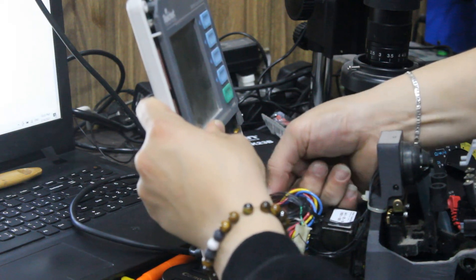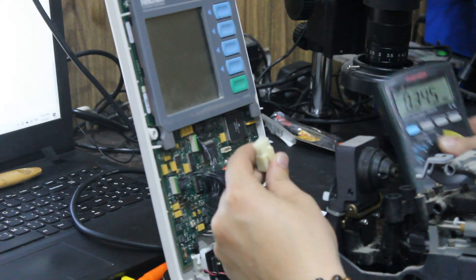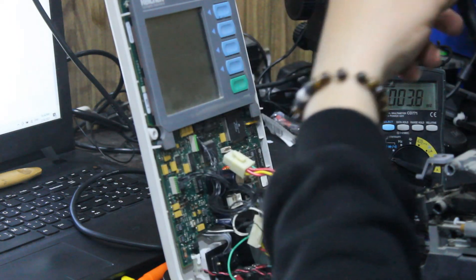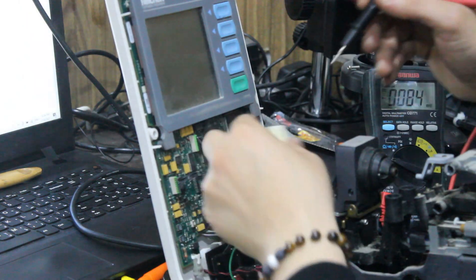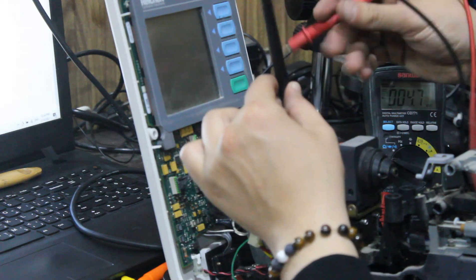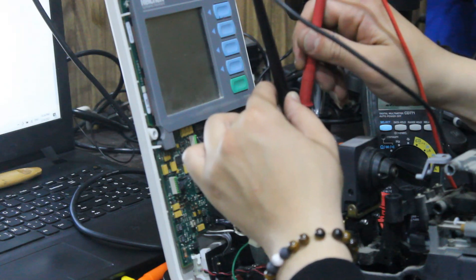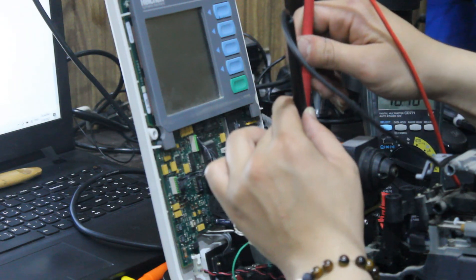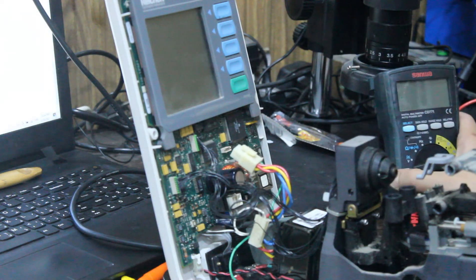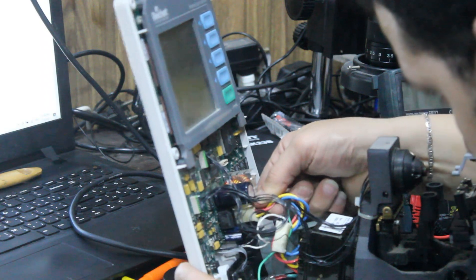Let me check this one with the multimeter. Red one, black — you see, 16.8 volts. So there is no problem in the transformer.